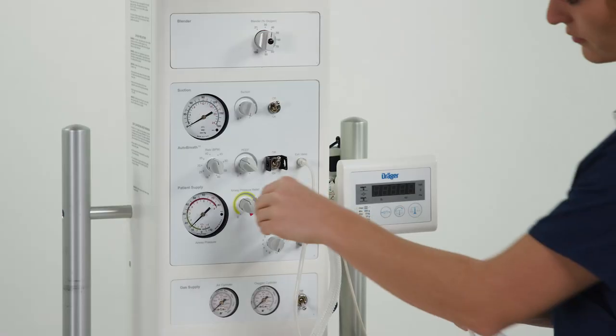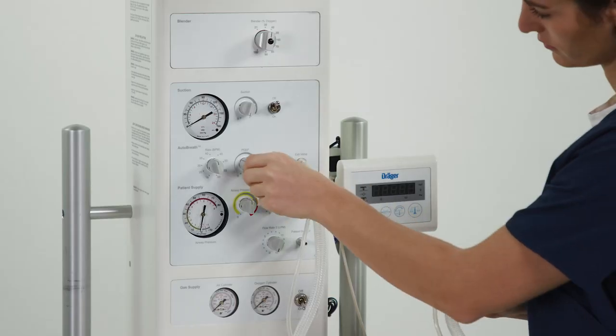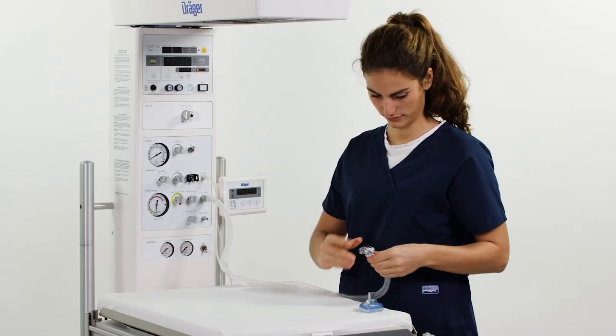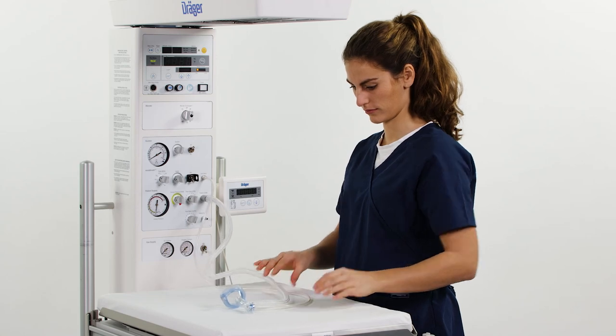And set the airway relief pressure or PIP. Occlude the bottom of the breathing circuit and set the PIP to the desired setting. Set the breathing rate using the knob. Connect the mask and start applying breath to the baby. Set the PEEP using the knob on the Resuscitaire.